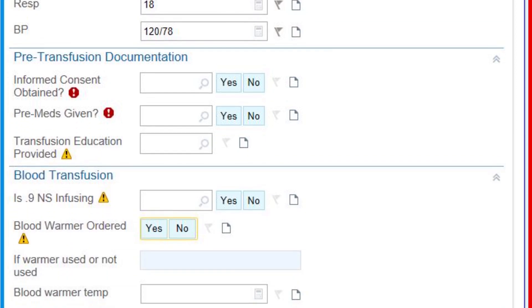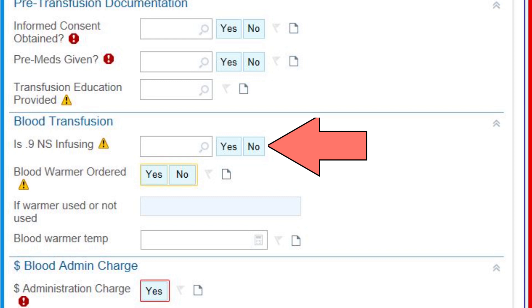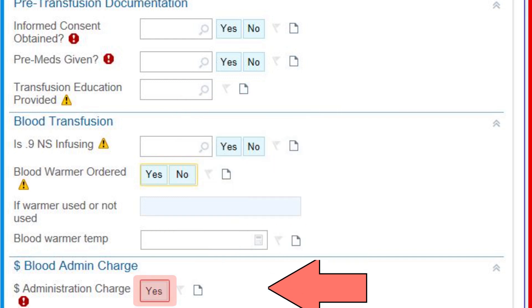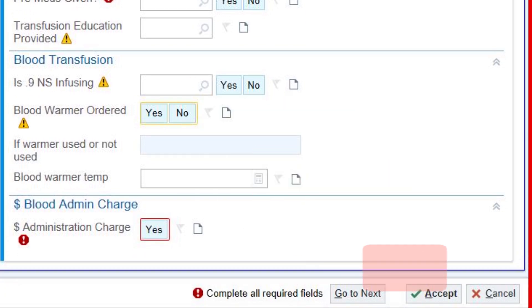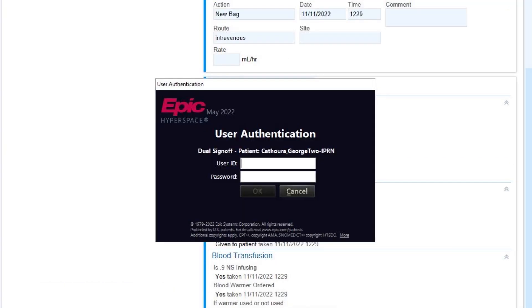Scroll down to address some more required fields. Verify that consent was signed, that any pre-medications were administered if ordered, that patient education was provided, and that normal saline is infusing. Remember, 0.9% normal saline is the only solution that is appropriate for use with a blood transfusion. Identify if a blood warmer was used, and finally choose Yes on administration charges to complete this sheet. After you choose Accept, it will give you a chance to review your documentation before choosing Sign Off at the bottom. It will then prompt you to have your partner sign in, verifying that they completed the double verification process with you and that you found no discrepancies. After they have signed off, they are free to leave, and you will complete the blood administration process for this patient.